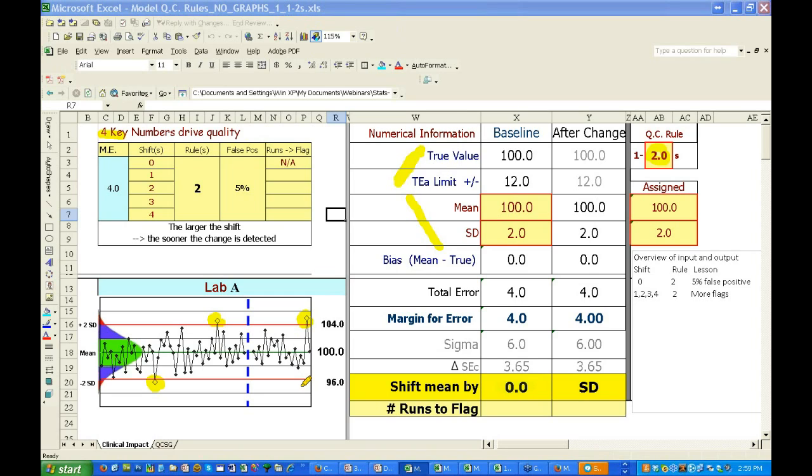If you move that up, as some people do in immunoassays or in hematology, and run 3 controls, then that number goes up to what? 3 times 5 is 15%. 1 in 6 or 7 runs, you're going to get an outlier. It's guaranteed. So we're not arguing with each other. We're just talking about 1 versus 2.